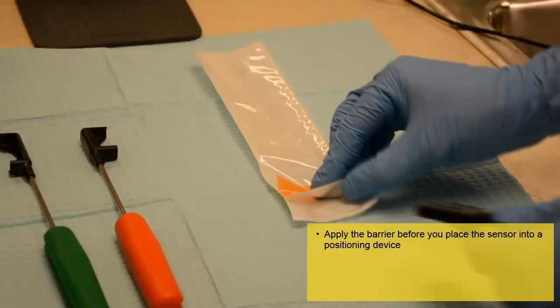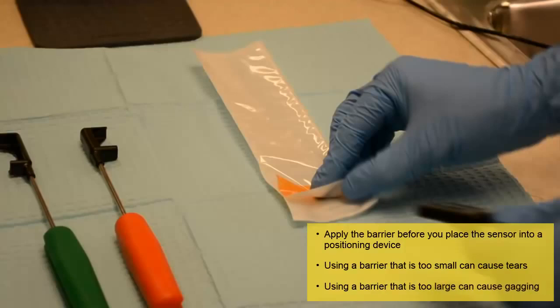To begin, select the appropriate barrier. Using a barrier that is too small could cause tears, which can contaminate the sensor. Using a barrier that is too large can cause discomfort to the patient and can trigger a gag reflex upon placement. Quick tip: using a finger cot on top of the barrier can help prevent tears during the X-ray exam.